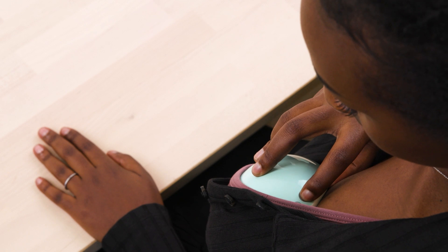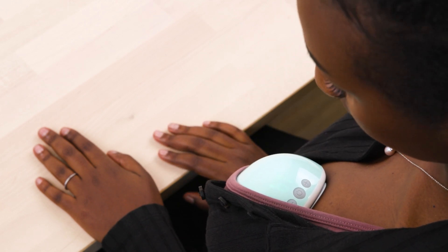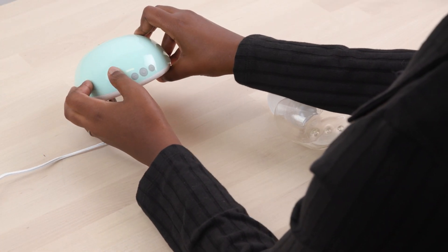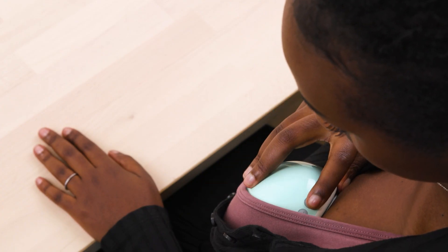Press the power button to turn the pump on and off. The pump will automatically shut off after 30 minutes for your safety. Use your pump with a fully charged battery whenever possible. It is recommended to charge the pump as soon as the battery level is under 30%.